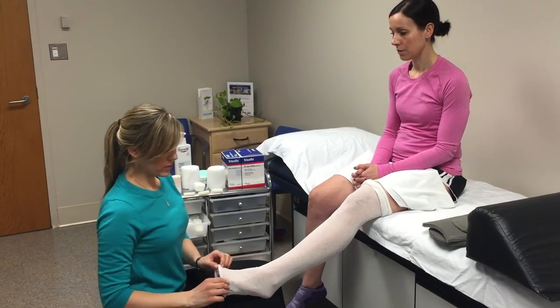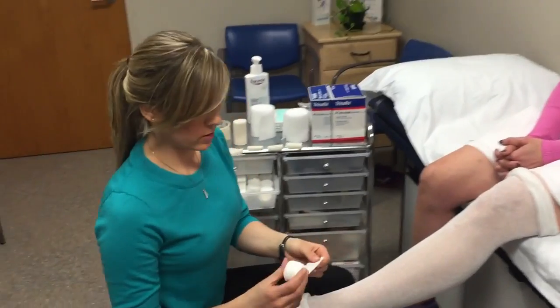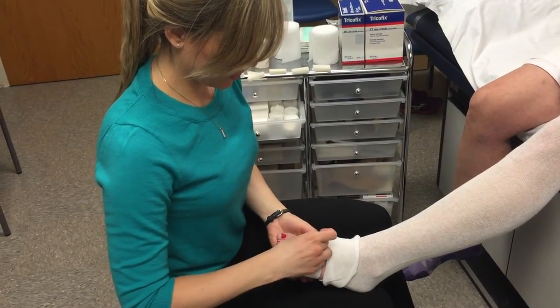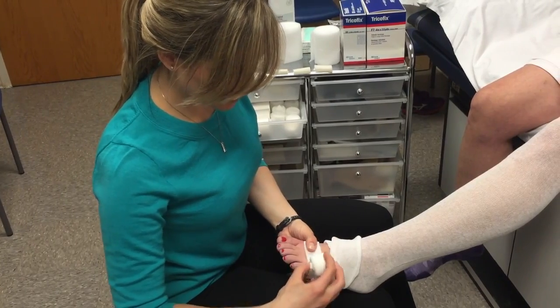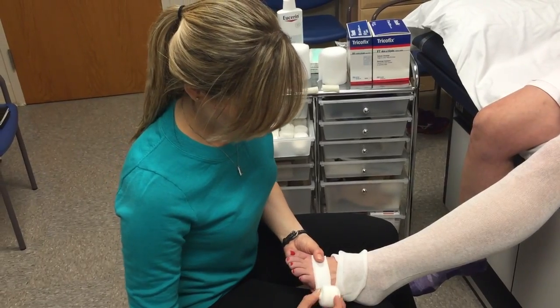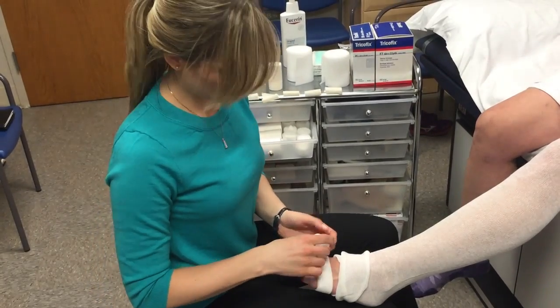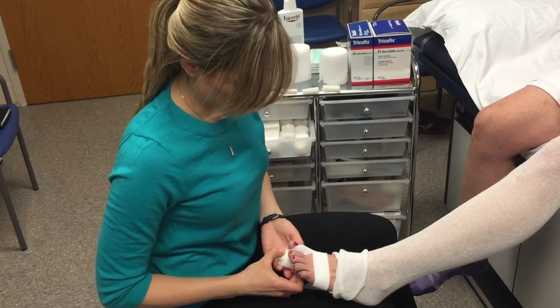Once you've done that, you can start by wrapping the toes with your stretchy gauze. First you want to anchor the wrap above the toes one or two times, and make sure that you are not pulling too tight because this is not meant to apply a lot of compression. Always ask the patient for some feedback. It doesn't matter which toe you start on, but you always leave the pinky out, and for me it's just more convenient to start with the big toe in this case.